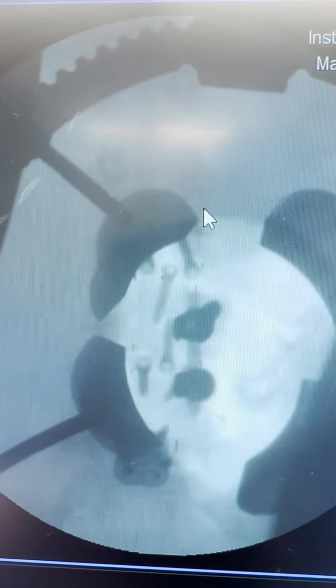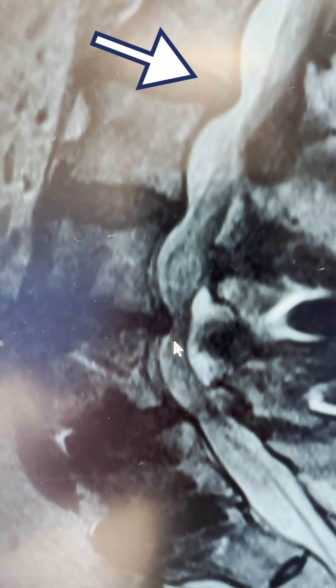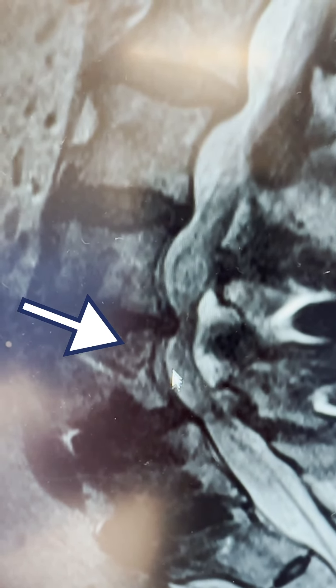Now we're doing the posterior portion. Here we are at a recent MRI taken right before surgery, about a week ago. There's still a little material back here in the canal on the right side — you can see that. It's stenotic, so we're going to open this up.